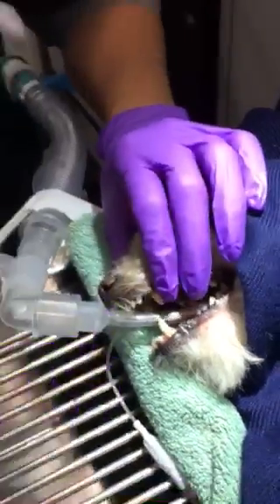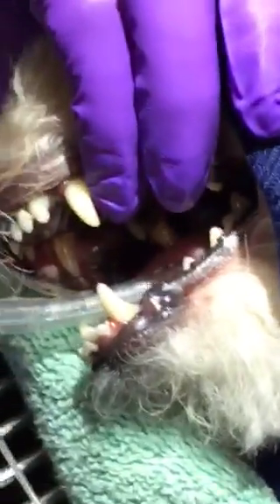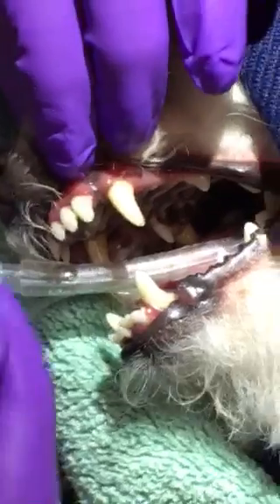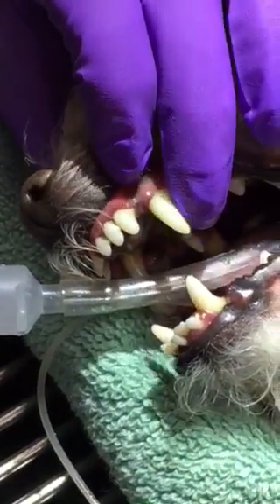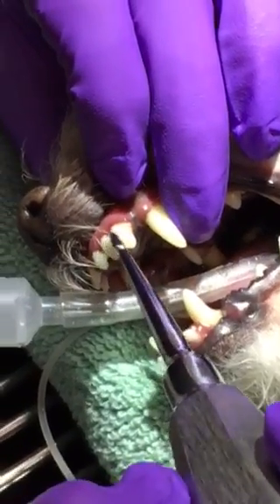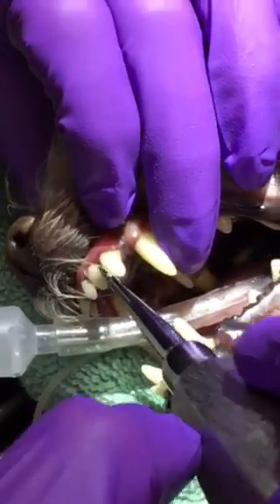For the sake of today and just giving you a very general overview, we're going to do this quick little incisor, and luckily Mim doesn't need any big extractions today. The first thing you're going to do is make sure the teeth are cleaned. After that, we use special instruments to loosen the area of the gum and the tooth.